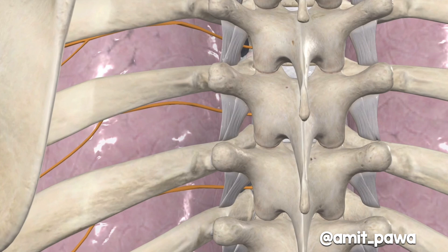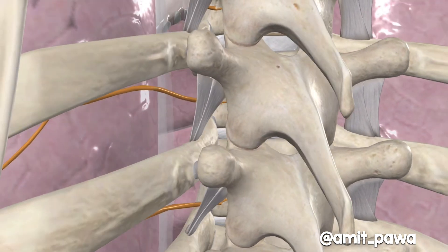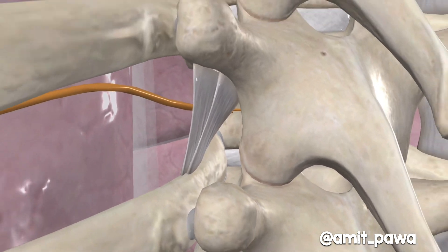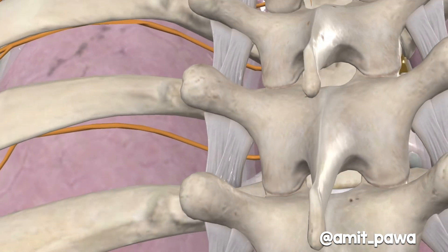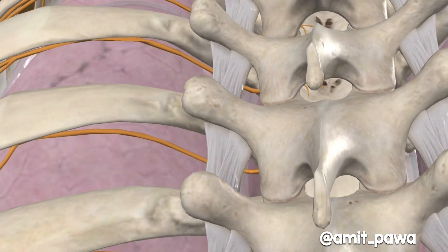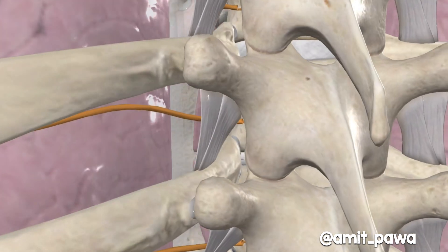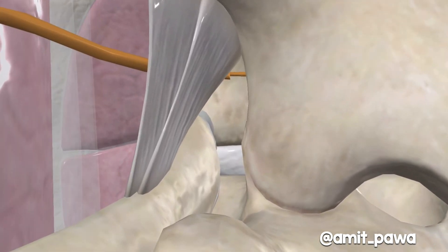Let's zoom in now over a spinous process. We can see the two transverse processes of interest, the superior costo-transverse ligament, and deep to that is the intercostal nerve in the paravertebral space. A true paramedian paravertebral block would involve coming in over the caudal transverse process, but I like to oblique it slightly, and I'll show you that video here — we're having that slightly oblique approach into the paravertebral space.